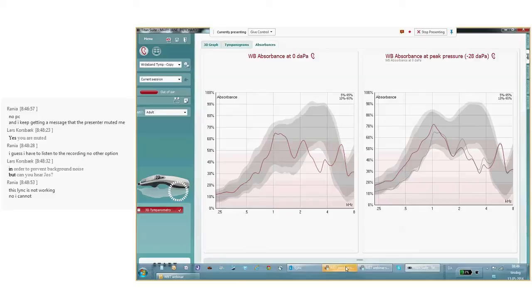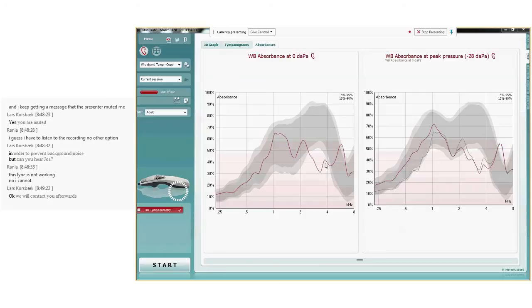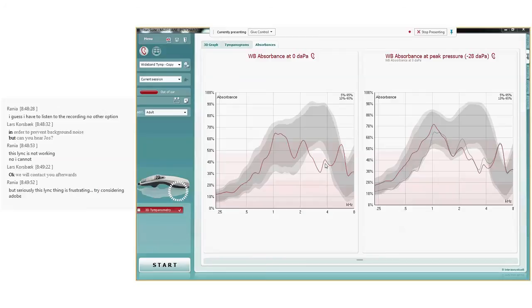Now, the big question is, how do we make an interpretation of these graphs? What you can see if I do a test on my ear, my ear always has relatively low absorbance in the region of 3,000 Hz. And so people then ask, you fall outside the normal area, so is my ear bad? I would say no, because I think my ear is good. But generally speaking, it is that people focus a lot on the details when they learn these new things. They really dive into the details and they try to see which corner, which frequency do I look at to make a diagnosis. And my answer is try to take a few steps back, look at the graph from a distance, and say, does it more or less fit in the normal area? Is it maybe more or less generally low, or is it high, or is it on spot? And make a general impression.